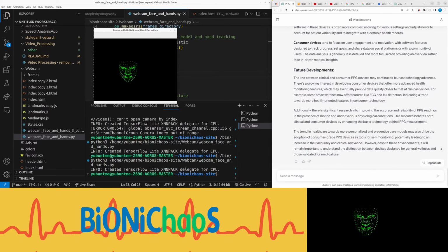Here's how PPG typically works. Light emission, a light source, such as an LED, emits light that penetrates the skin. Absorption variation, the blood vessels absorb varying amounts of light during the pulses that correspond to heartbeats, which is affected by the blood volume changes in the microvascular bed. Detection, a photodetector measures the light that is not absorbed by the blood. This signal fluctuates in time with the cardiac.